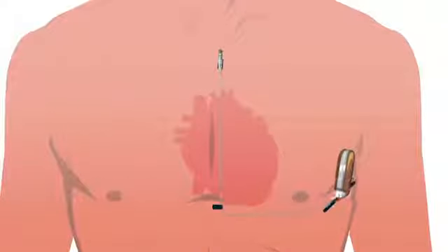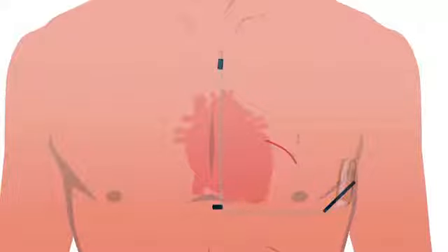Once the system has been implanted, most doctors test the defibrillator and adjust the settings to work best for the patient's heart. This includes inducing an irregular heart rhythm, allowing the S-ICD system to detect it and automatically restore normal sinus rhythm. Finally, the doctor closes the incisions to complete the procedure.